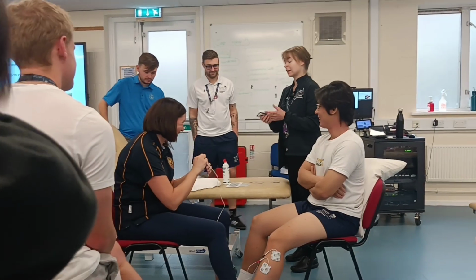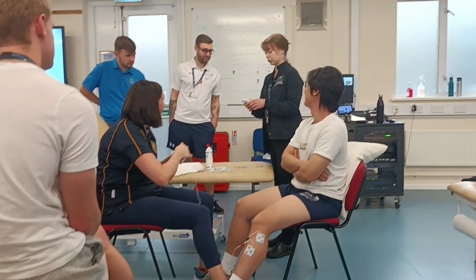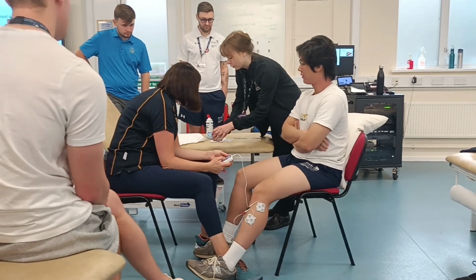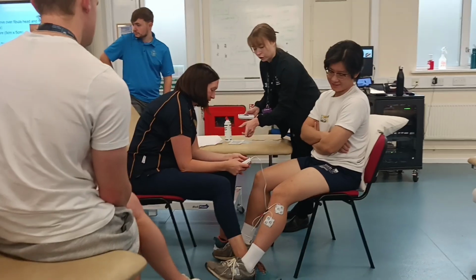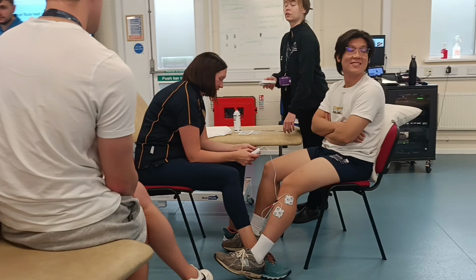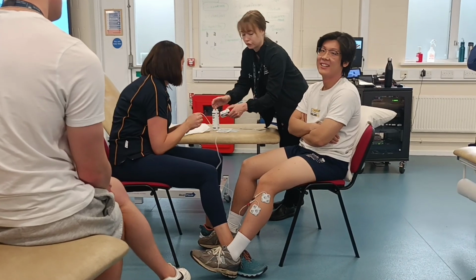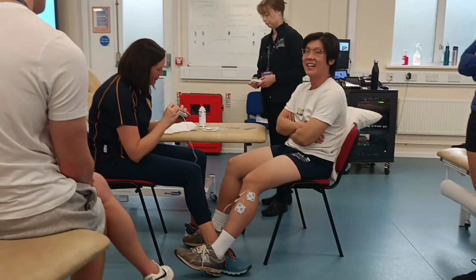No, I had exactly the same thing when I was doing it on the patient the other day. And it didn't like the electrodes. It was saying that there was too much resistance. Yeah, it goes up and then it's not. Is it giving you that symbol? Yeah. So it doesn't like the electrodes, or there's something about the connection. I had to problem solve this for ages. So this one is saying it because it's not connected to anything. Oh. Try it on that one. And if it's not that, I'd say it's the electrode. I have to say I've never had it do that before.